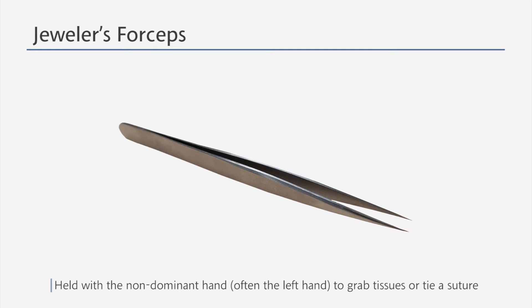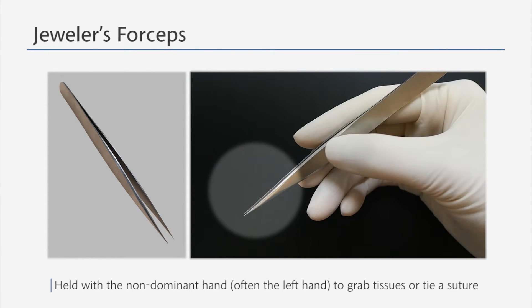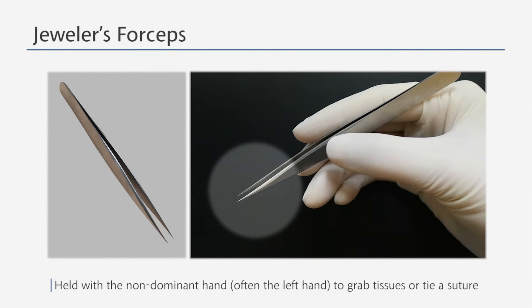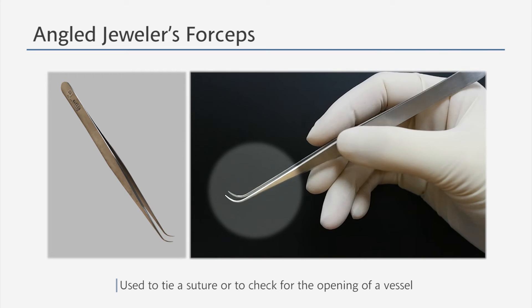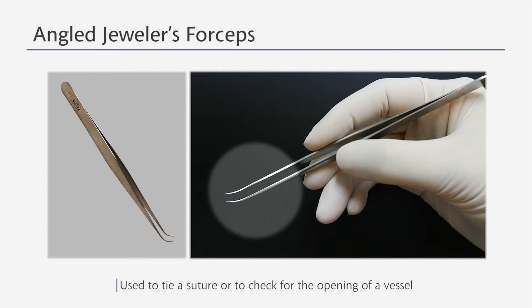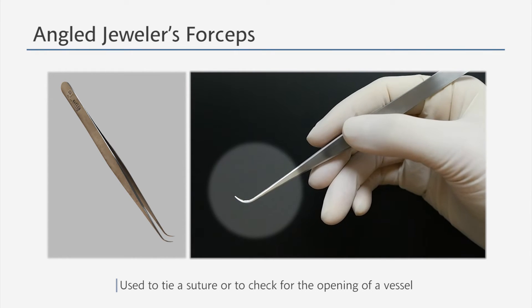Jewelers' forceps have very thin and pointy tips. They are often held with the non-dominant hand to grab tissues or tie a suture. Angled jewelers' forceps have bent tips and are a modified form of regular jewelers' forceps. They are used to tie a suture or to check for the opening of a vessel.